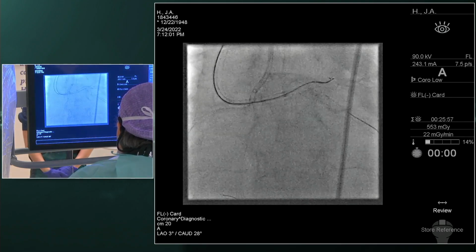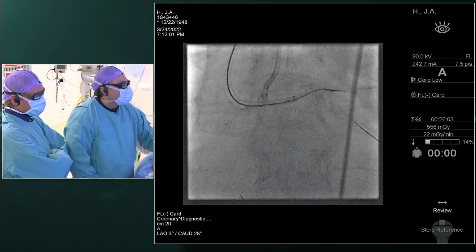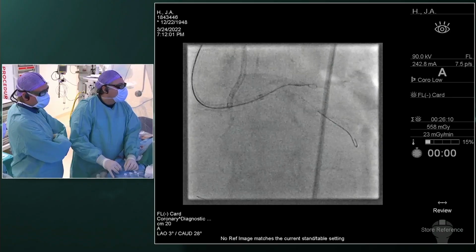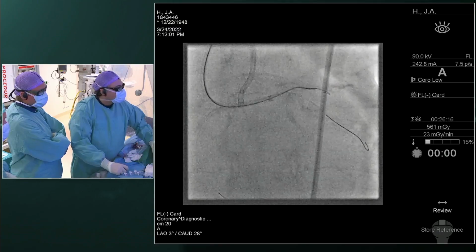So maybe a diagonal. It can be that we are in a diagonal, as Jeroen is suggesting, because it's going down. We might need to redirect the knuckle, because this looks like a diagonal. So it seems we are dissecting a diagonal.